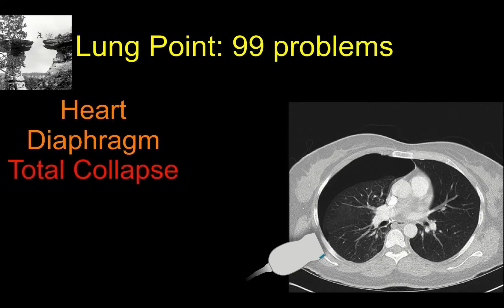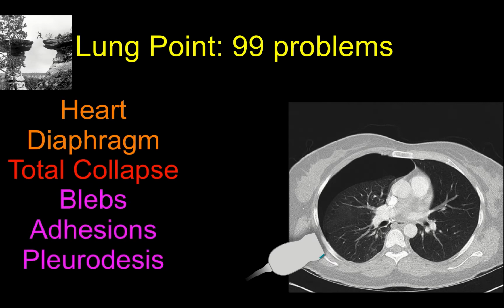You should also realize that if the pneumo causes complete circumferential separation of the pleural lining, you won't see a lung point. The silver lining here is that those patients usually have those more classic findings of tension pneumothorax, like mediastinal or airway shift and jugular venous distension, making it much easier to justify empiric decompression. Finally, there are other lung features which can cause focal absence of lung sliding, such as blebs, adhesions, and pleurodesis. How do you get around these?